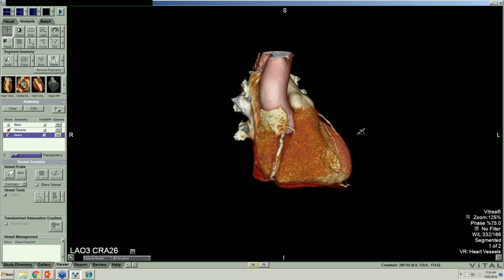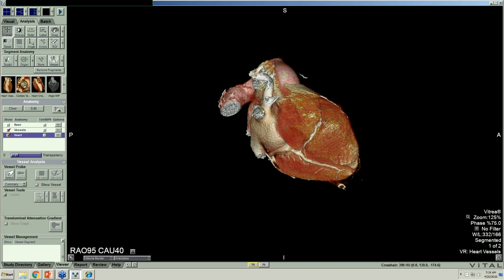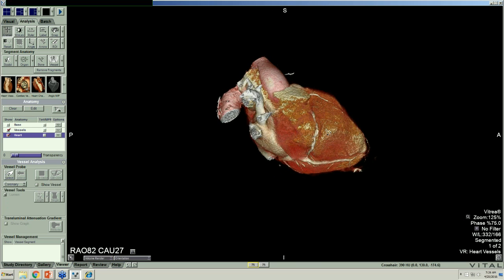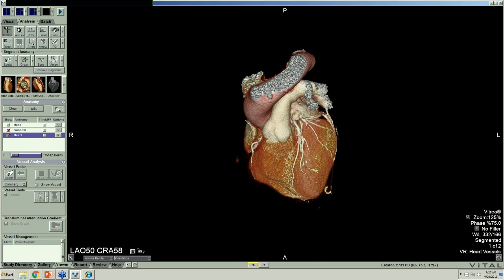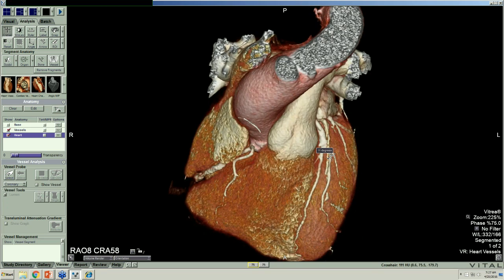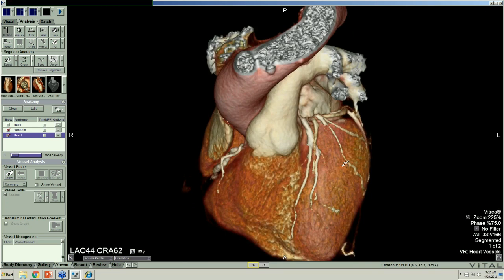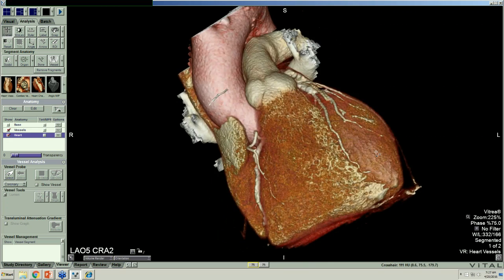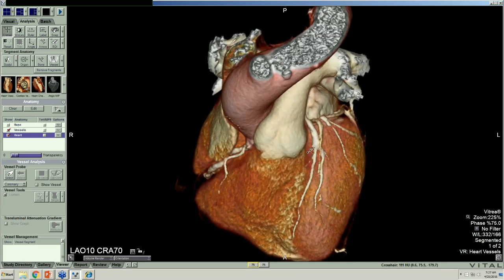And so we can look at these coronaries and you can see there's some stuff in there. You can see just from the outside there's been significant changes and positive remodeling in the vessel, where it gets bigger over here and then smaller over there and then bigger over here and bigger over there. And so definitely it's got lots of ripples, and so there's been an atherosclerotic process that's been going on in this patient. Here you can see a little calcific lump that's peeking out of the vessel where it's positive remodeling. There's another little ripple of positive remodeling. Here's positive remodeling over here. And so these vessels, basically, if you did time-lapse photography, you'd see they were undergoing a lot of changes all the time. This whole area here appears to be ectatic and calcified.